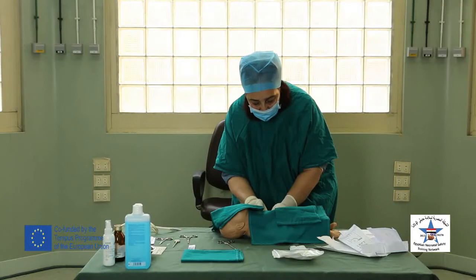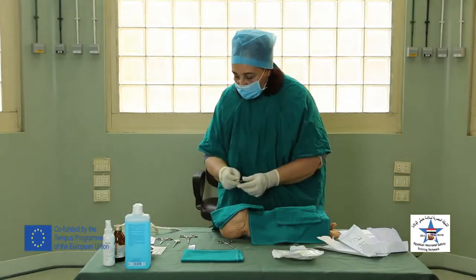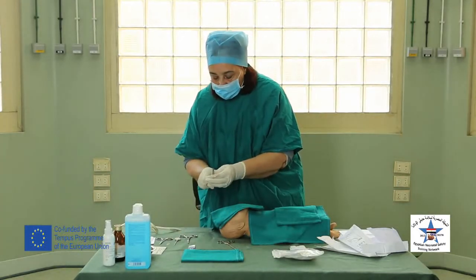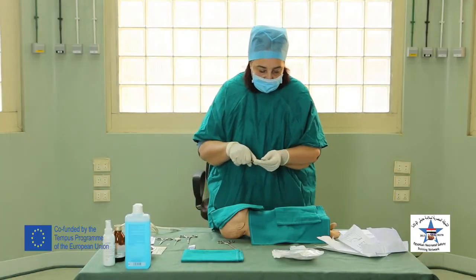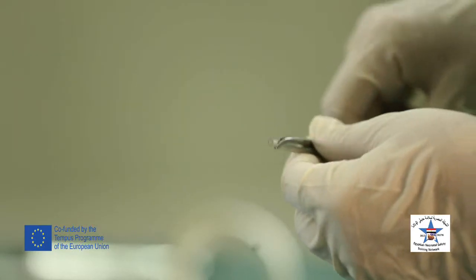And then I will withdraw the curved forceps and get the chest tube and hold the tip of the chest tube with the curved forceps so that the tip is slightly protruding beyond the tip of the forceps.